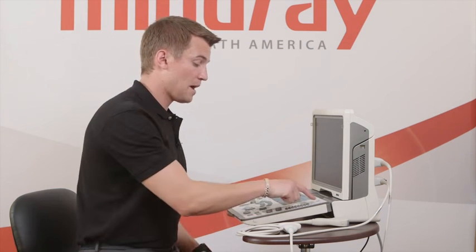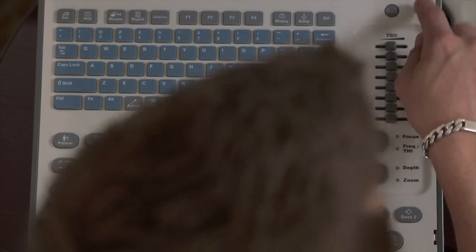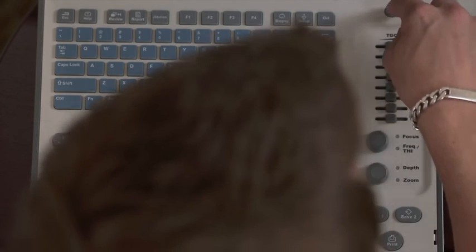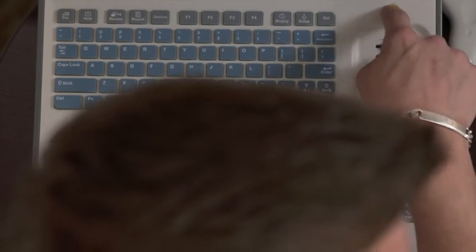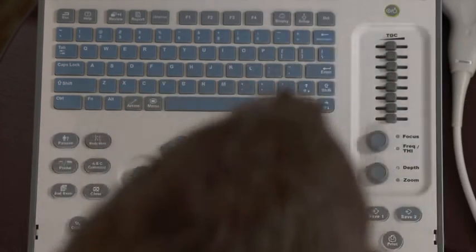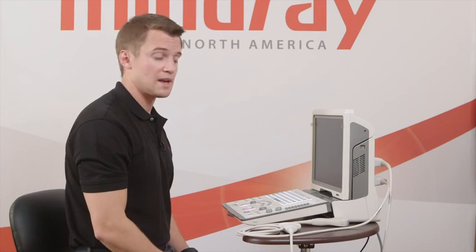Now we'll power up the machine, which takes about 30 seconds or so. The power button's right up here in the top corner, and again, it takes 25 to 30 seconds.